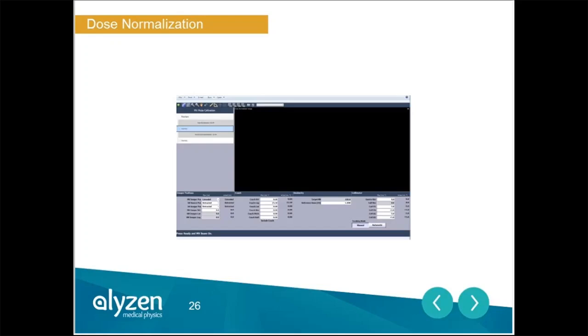You just need to make note of what it is, because when you put your output factors into the algorithm, that has to match whatever you calibrated. If you calibrated it at 1 CU for 100 monitor units, but your output factors are calibrated for 100, obviously you're going to see 100 times different, and you're basically not going to see any dose compared to your predicted, and very quickly catch your mistake.